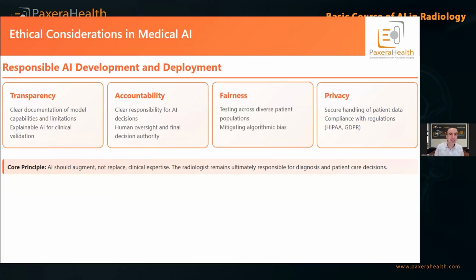One very famous example is in chest X-ray, where some algorithms are facing a lot of problems because they were originally not trained on emergency data. An emergency department means there are wires on the patient's chest, catheters, an EKG cable, and this is totally different from a patient doing a normal chest X-ray.